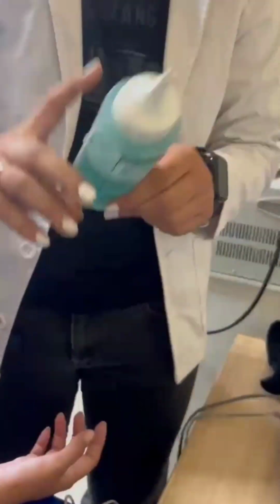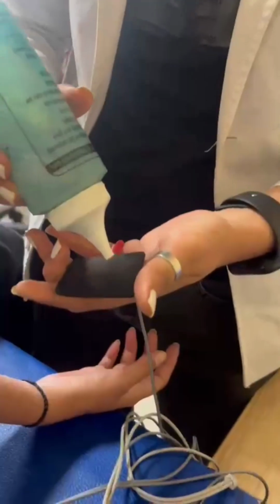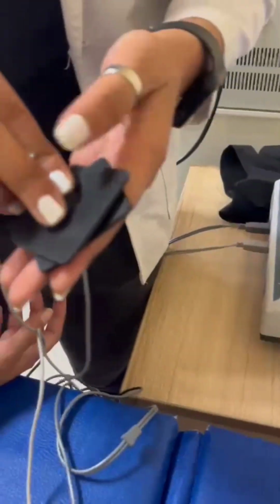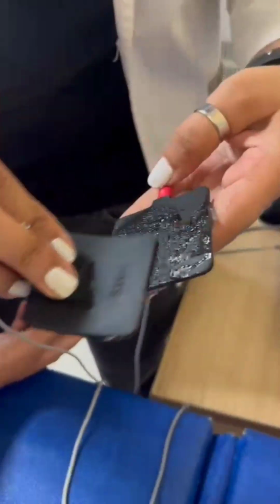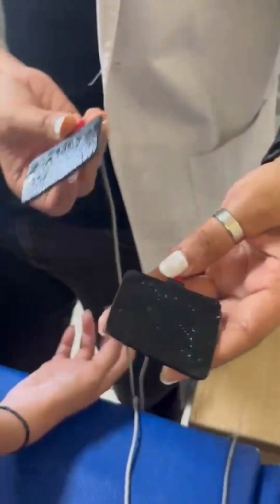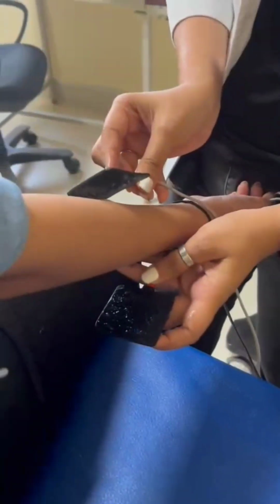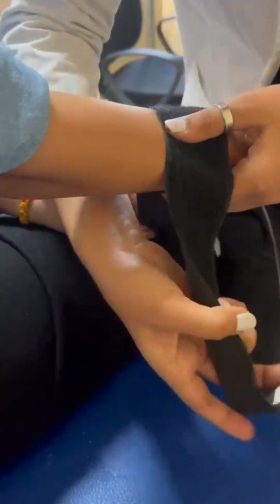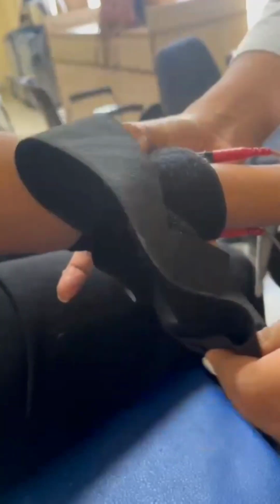And here we can use the aquasonic gel to place over the electrode pads and spread it all around. And place them on the trigger point, or as we can say, the point with higher intensity of pain. Fix the electrodes with the help of a band.